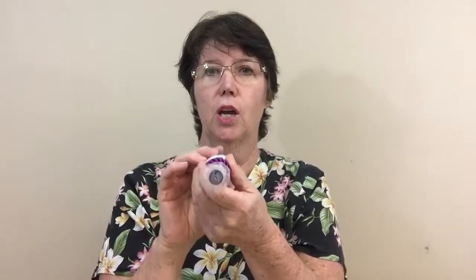Depending on how far in the anastomosis is, you go in just far enough — lube it up, go just far enough in through the anus into the rectum — so that you can get a seal. Then you take out the obturator and you close the little window and screw it shut, so now you have your seal.